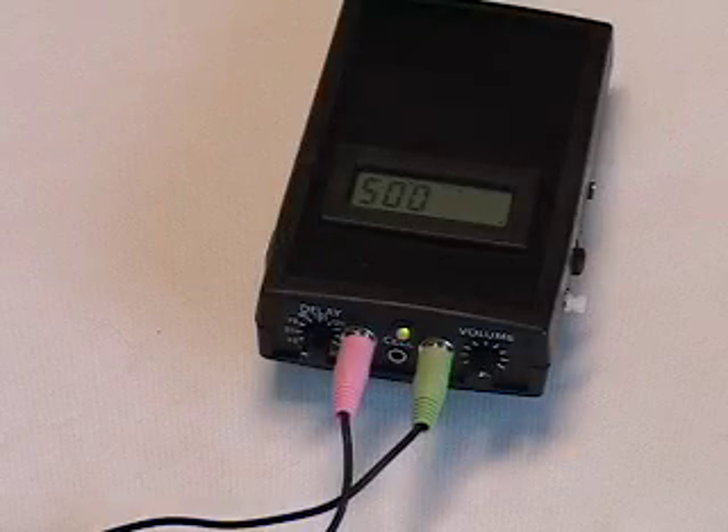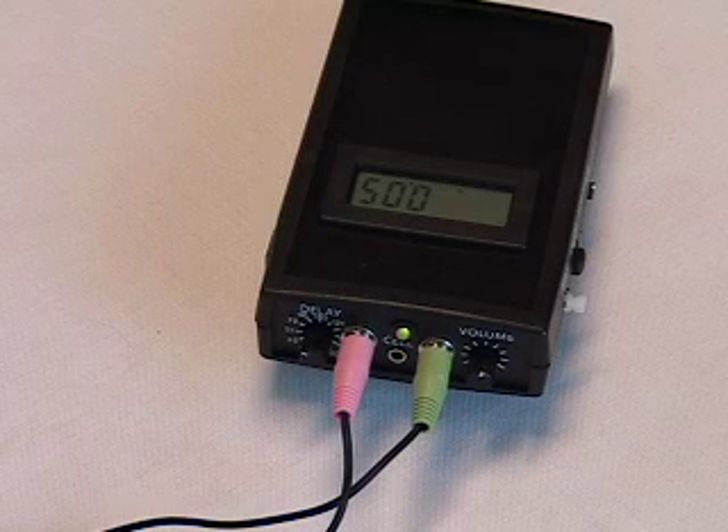Now I'm going to show you some features of the Pocket Speech Lab and the Big Mouth devices. The Pocket Speech Lab and Big Mouth listen to you and analyze the frequencies and amplitudes in your voice.